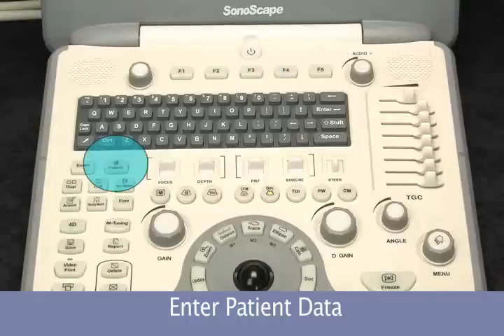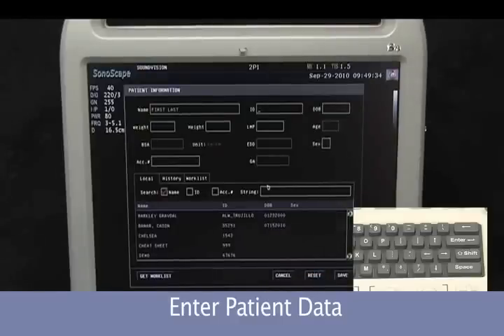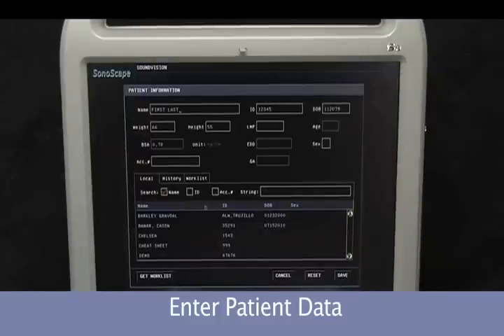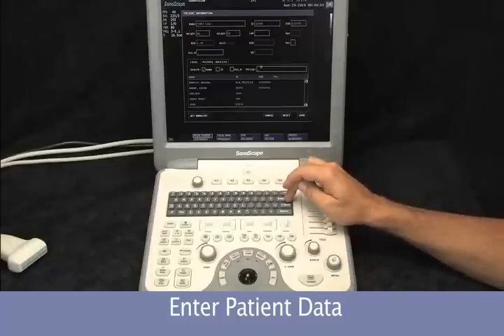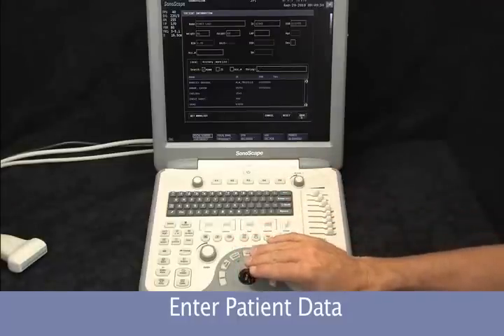Now we'll just begin the exam. Select 'Patient,' type in the patient name, then hit the enter button to move through the different fields such as date of birth. You can also select a previous patient already in the system to continue with their study. When ready to begin the exam, we simply come down and select the save button.